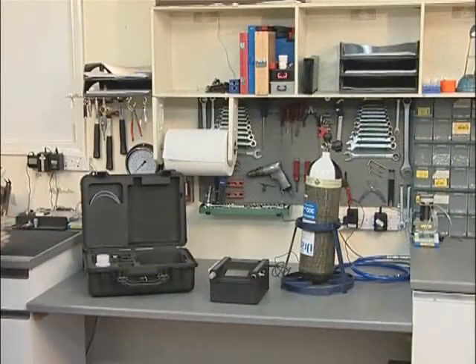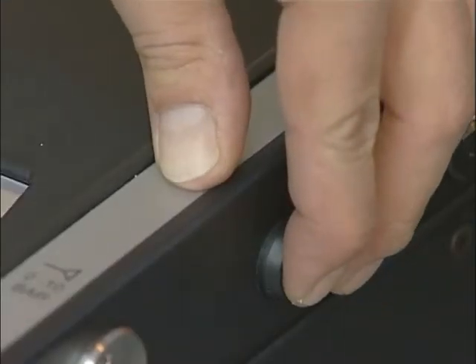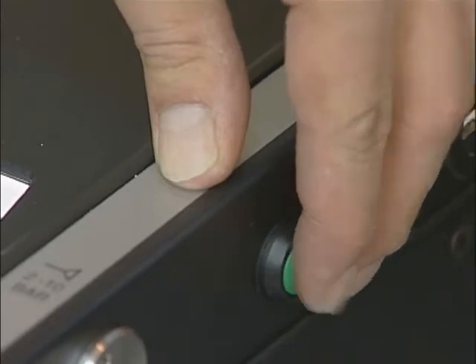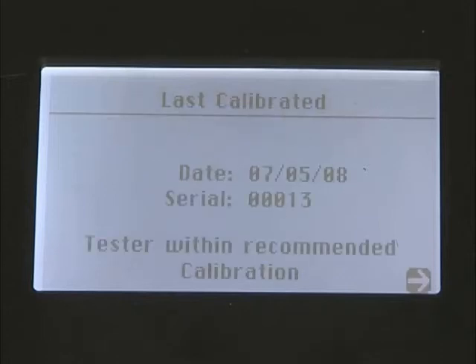To carry out a test, first switch on the machine by pressing and holding the ON button, which is on the right hand side of the unit, for approximately 3 seconds. The display will show the model, then the serial number, date last calibrated, and whether it is within the recommended calibration period.